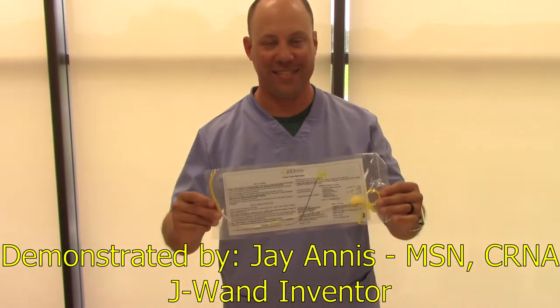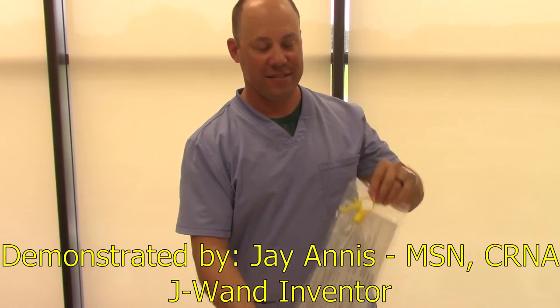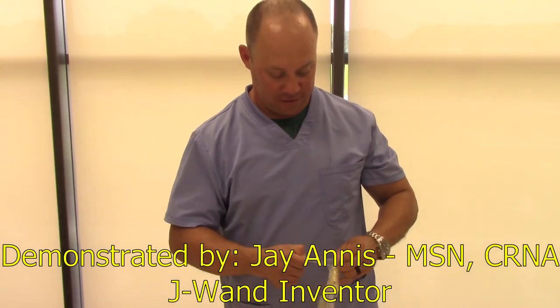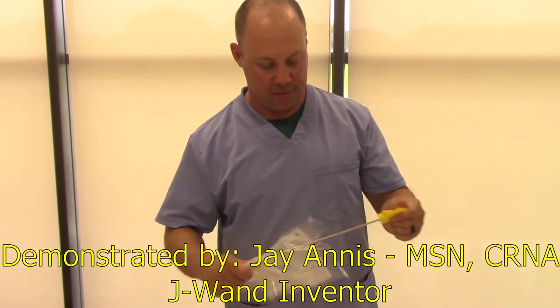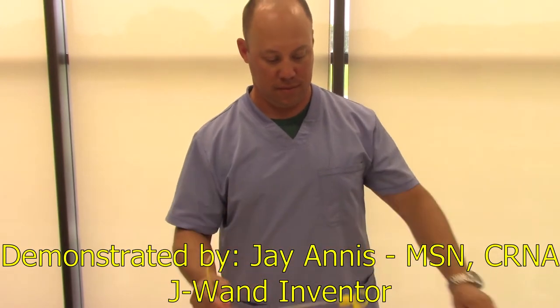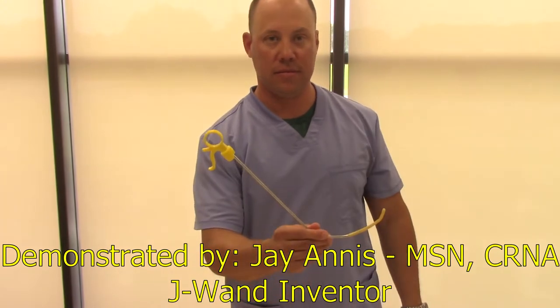Through a focus on medical device innovation and patient safety, D.R. Burton Healthcare is proud to introduce the J-WAND, a semi-rigid intubating stylet that can be used across all subspecialties for safe and effective placement of endotracheal tubes during the intubating process.